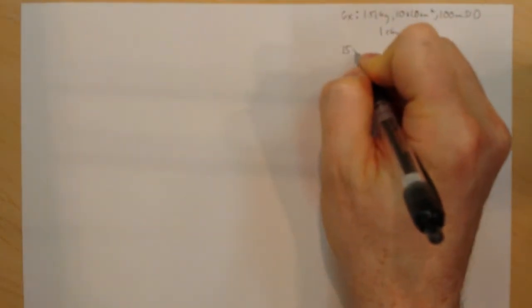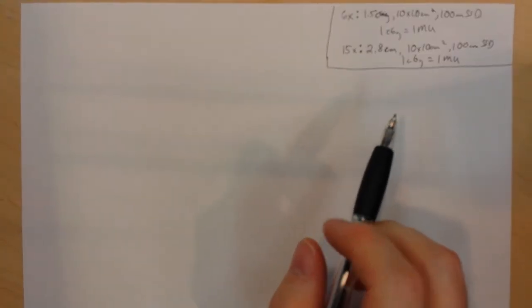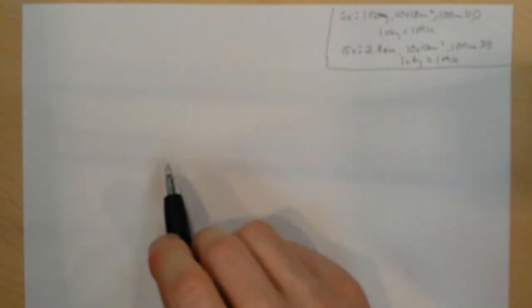For 15X, I'm calibrated at 2.8 centimeters, 10 by 10 centimeter squared field size, 100 centimeter SSD, 1 centigray equals 1 MU. So for all podcasts from here on out, this is the machine calibration that I'm using. At your particular center, pay very close attention to the type of calibration that they have. They might be calibrated at 100 centimeter SAD instead of SSD. That's another common calibration. Usually it's one of the two. Maybe they're calibrated to deliver 1 centigray per monitor unit at a different depth.